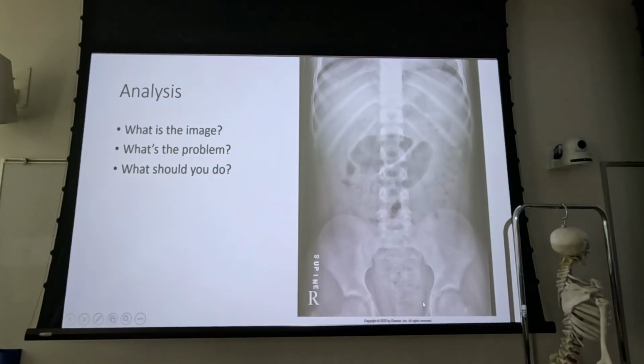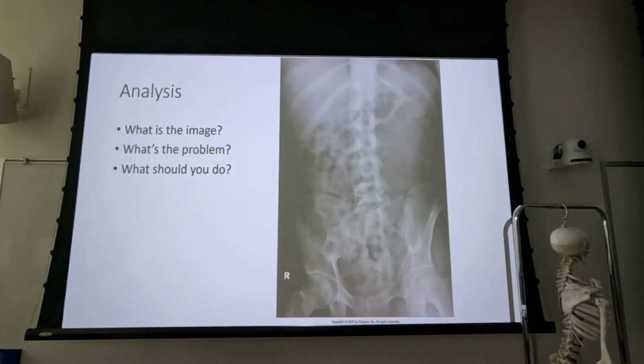But if you look at this patient, this is a pediatric patient. So I would not go back and immediately reshoot this patient. I would probably present this to the radiologist and say, do you need that bladder shot? Just because it's a pediatric patient, what are you going to be shooting at for that bladder shot? Yeah, you're shooting right into their stuff. So I would definitely ask before reshooting that or shooting a bladder shot on it. Now for your next one, if you have to shoot another one, learn from this mistake and fix it and get it right the next time.